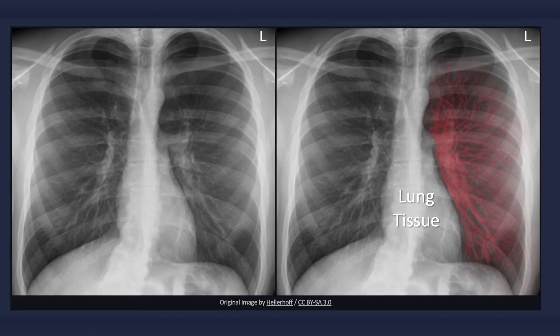Within the confines of the visceral pleural lines, you can see lung tissue, which can be identified by the presence of lung markings. The contralateral lung, however, may appear to have more prominent lung markings due to increased vascular flow.